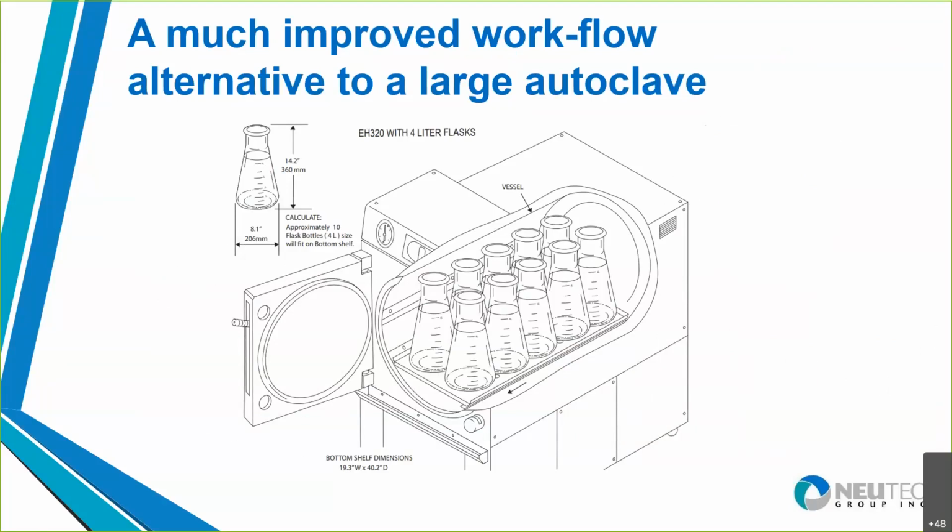They have to be handled carefully. And the amount of media or material that you can put in at the same time is limited by the space being taken up. In terms of advantage over a large autoclave, these media preparators' purpose is to make media, so they're really effective at doing that. And again, as we talked about, they can be hooked up for a continuous operation.